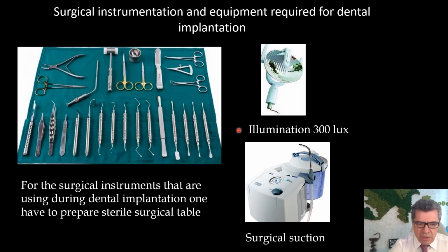For the surgical instruments that are used during dental implantation, we prepare a sterile surgical table. And illumination should be more than 300 lux. But one of the very important pieces of equipment is the surgical suction.